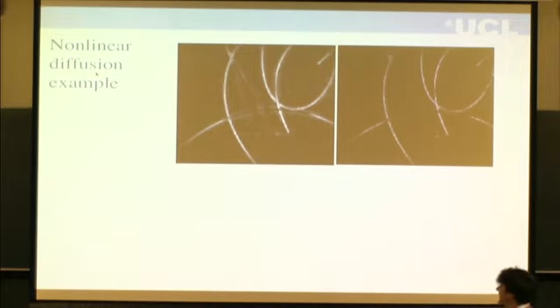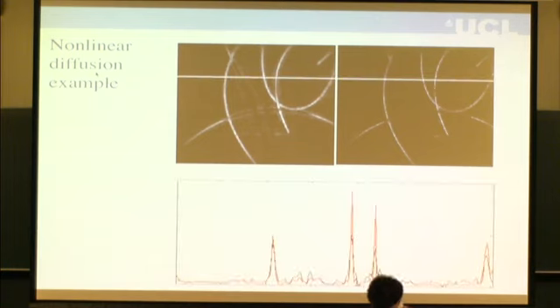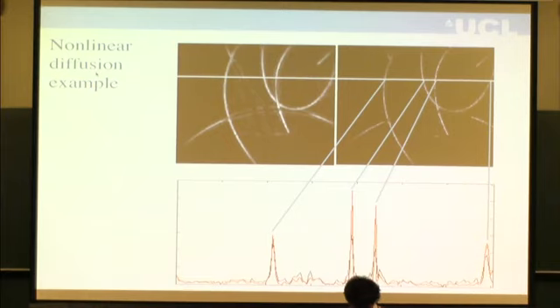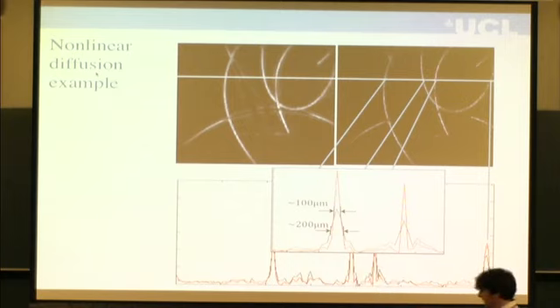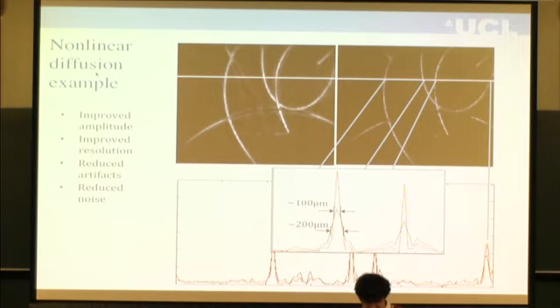So if we look at, this is a slice through that previous fly-through data set. We can see some of these limited aperture problems coming up here, and they're going away here. What you can't see is the amplitude on these. If I plot a slice through here, this is the original one, which is a black line here, and this is the reconstructed one after iteration, which is the red line. So we've recovered what we expect to be close to the real amplitude, and importantly, we've also improved the spatial resolution. I'm not entirely sure why, but we have. So it was 200 microns. We know the vessel was about 100 microns, the blood-filled tube, which is about what we recover. So it's an ad hoc technique, but it does help in practice. Okay.